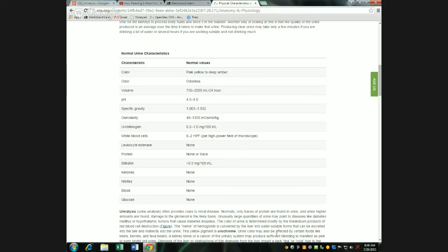A more clinically relevant odor: what would it suggest if you smell the sample and it smells sweet? How do you sense sugar? We did senses at the beginning of the semester. What interacts with sugar in your sensorium?